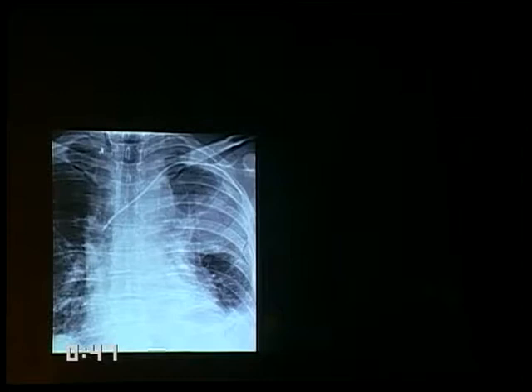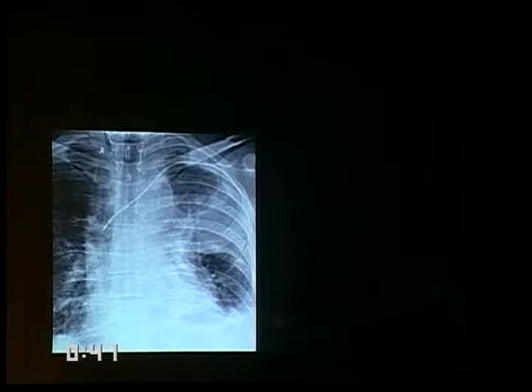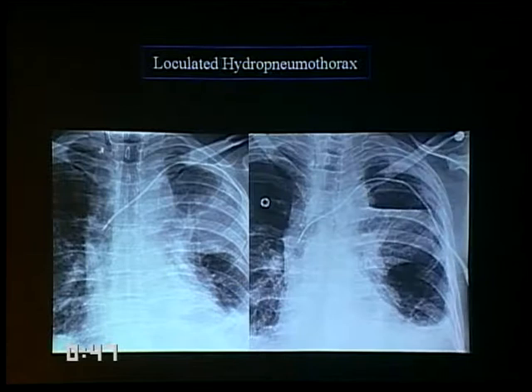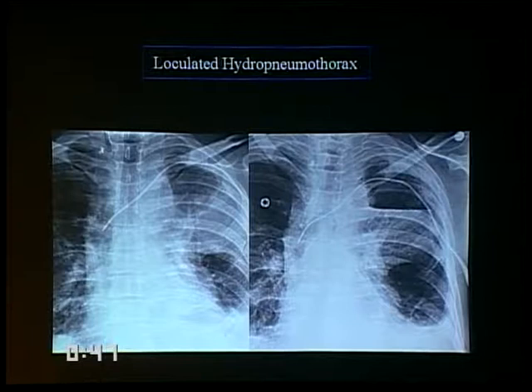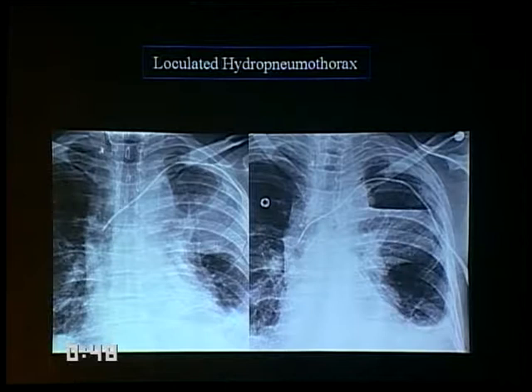Here's a case with hazy opacity over the upper lobe, radiolucency above that — is this pneumonia or consolidation? This was done in a semi-erect position with the typical 45-degree x-ray projection. On a repeat exam the same day with a horizontal x-ray beam, now we have an obvious hydropneumothorax. This is a reminder that we shouldn't expect to see air-fluid levels on portable chest x-rays because portable chest x-rays rarely have a horizontal x-ray beam. You will see one on an erect chest x-ray with the patient standing because then the beam will be horizontal. Be aware that you're missing that information.